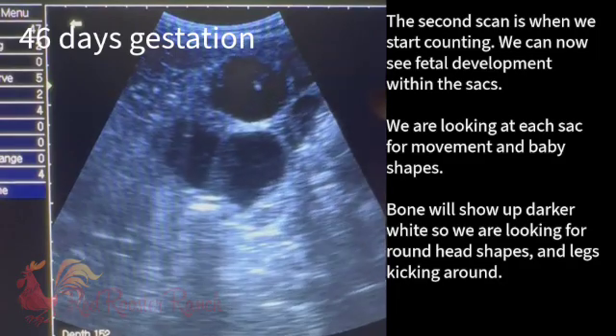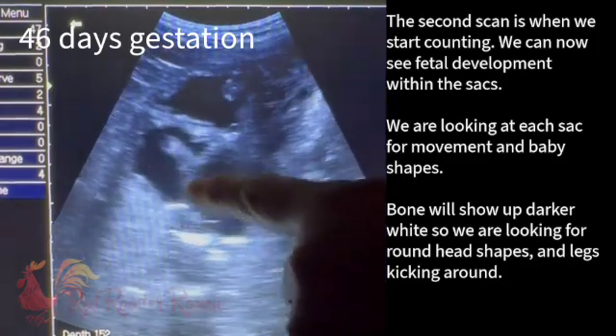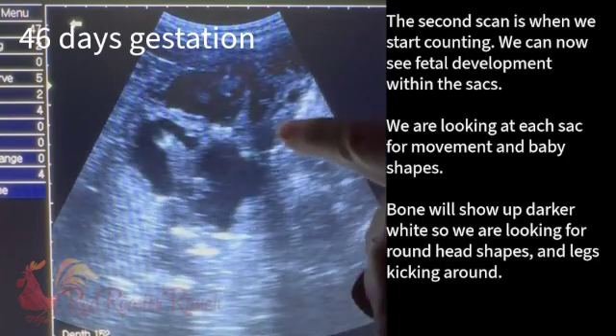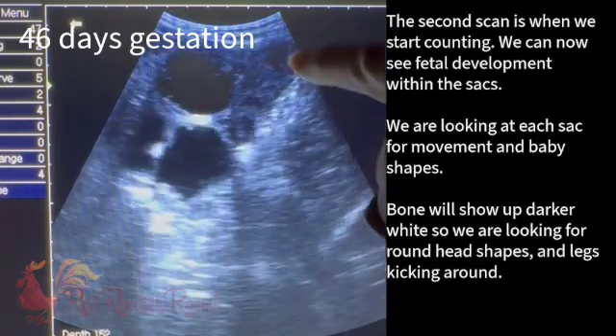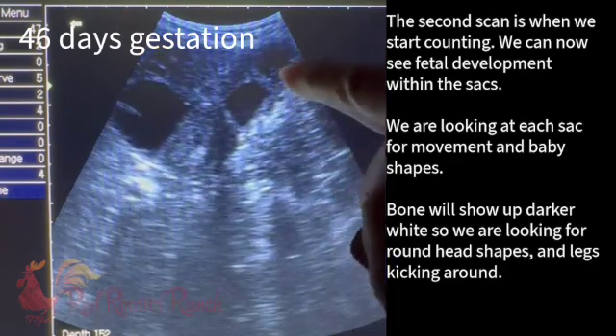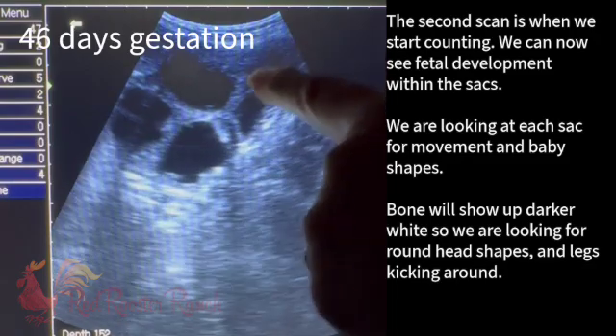For sure we see one. I see one — there's a baby there too. So one, two, probably three, but we for sure see three sacks. And then that looks like a placental sack. That could be a sack at a different depth. I'm going to explore those in a sec.